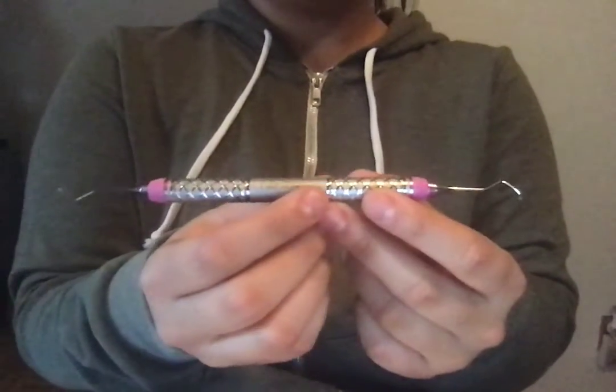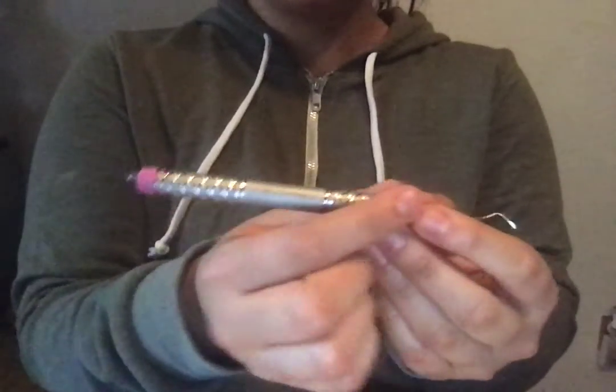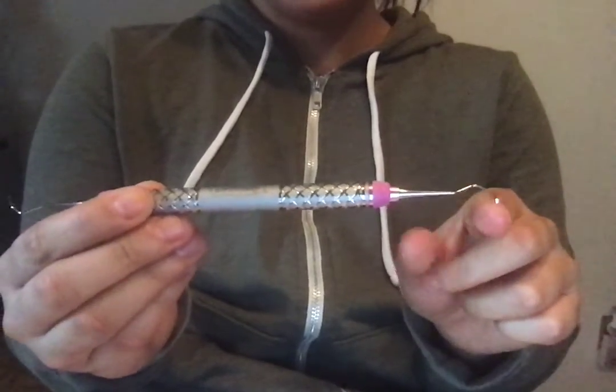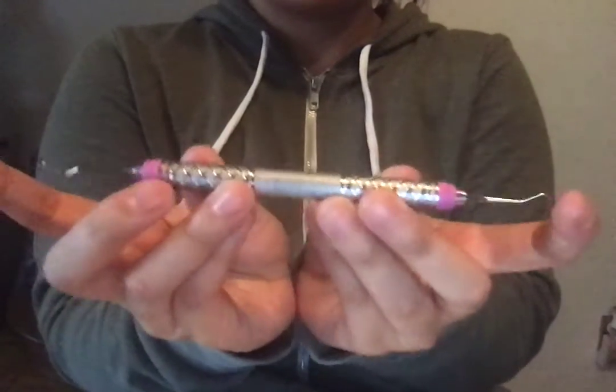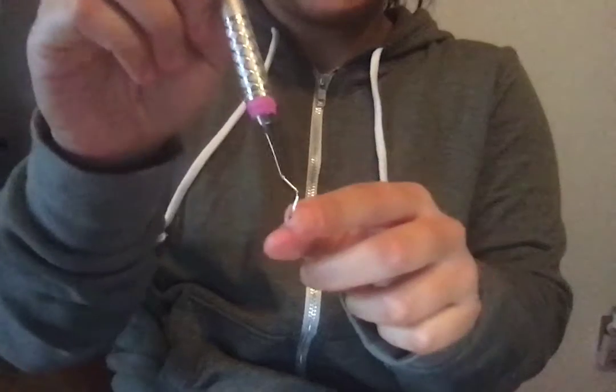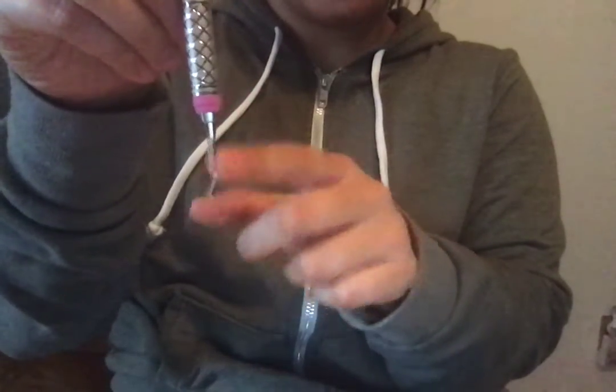Before we move on, let's talk about the instrument itself. This is the handle, this is the shank, and then this would be your working end. This instrument, as you can see, has two cutting edges, and the face of the blade is at a 90 degree angle to the terminal shank.